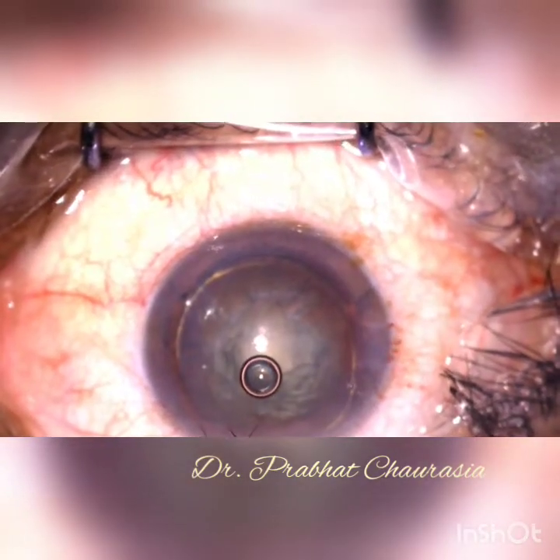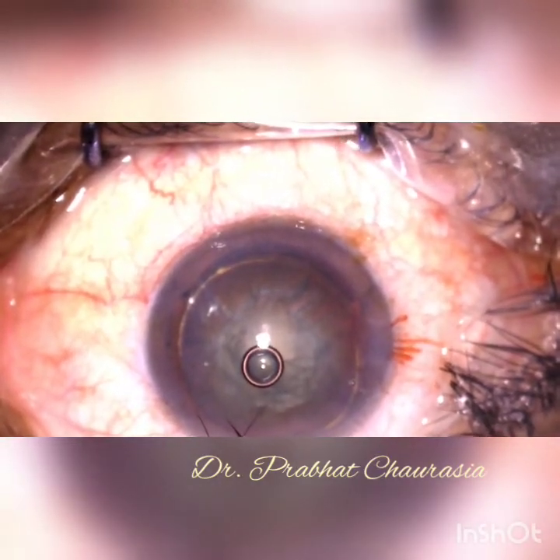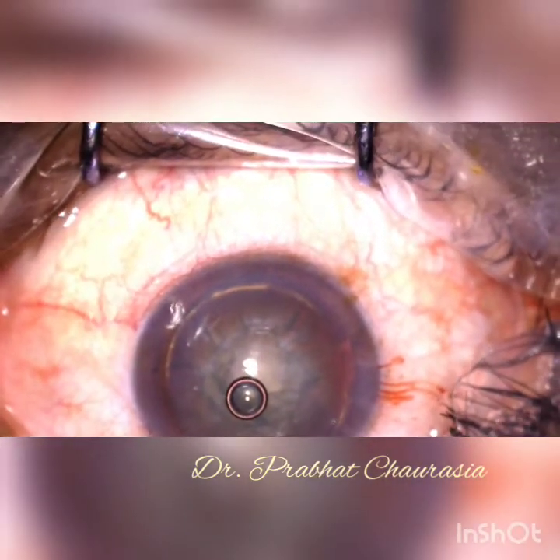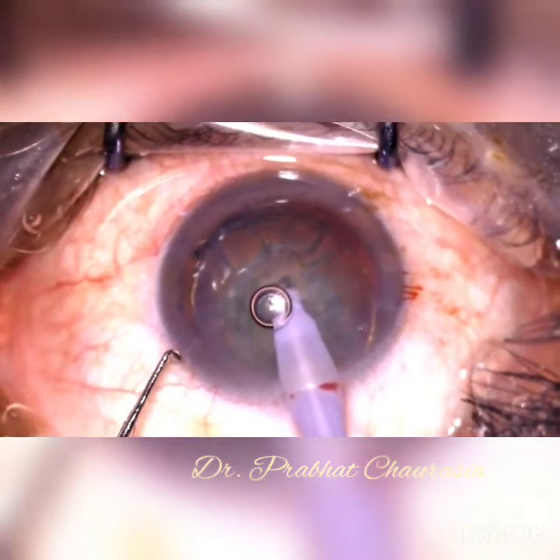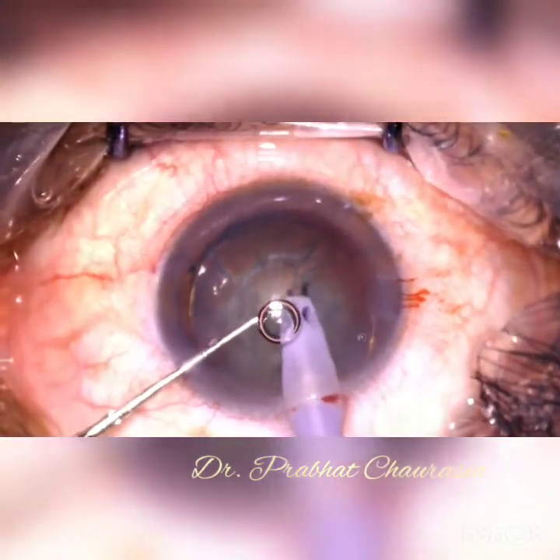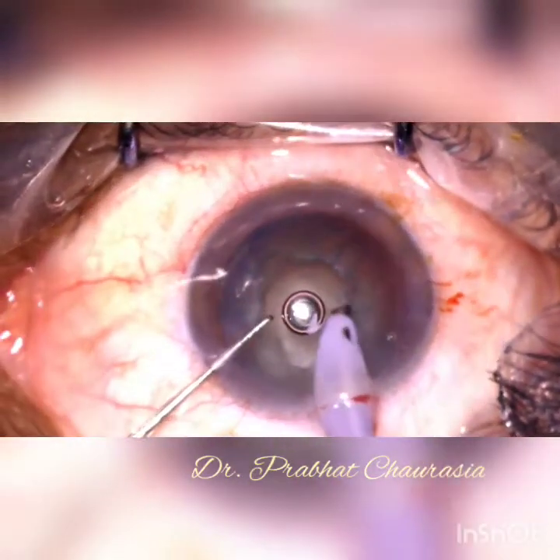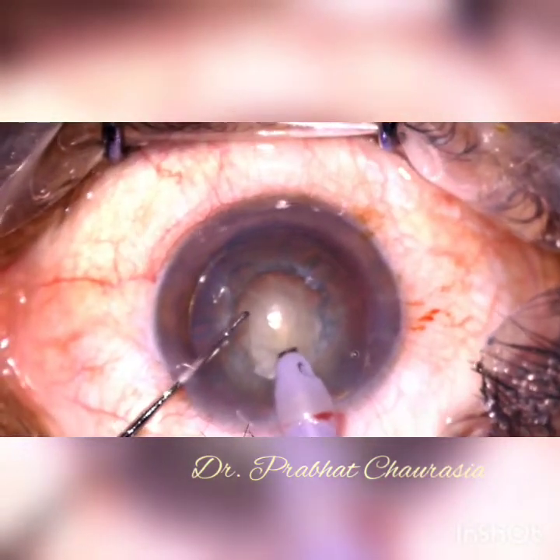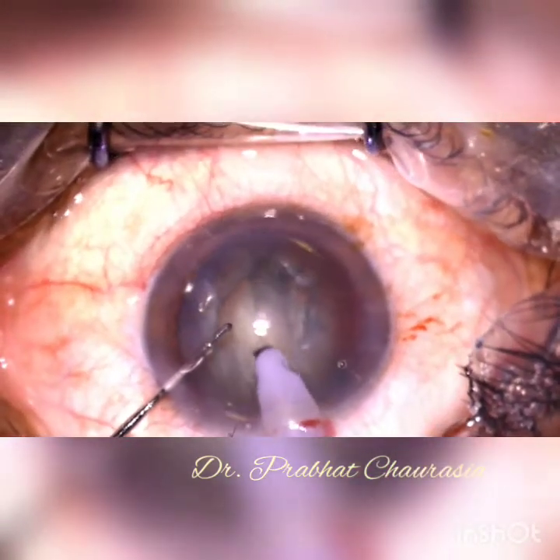Again inject some HPMC and then start the phacoemulsification surgery. Insert the phaco probe from the main port and from the left-sided side port insert the chopper. In this technique, I will show you the modified direct chop technique, in which first I emulsify some superficial cortex and then make a small trench in US1 mode.